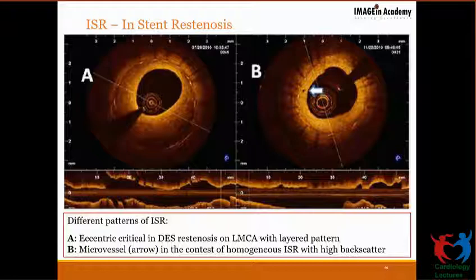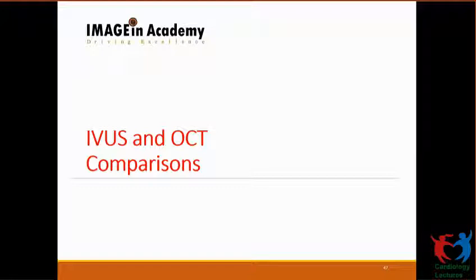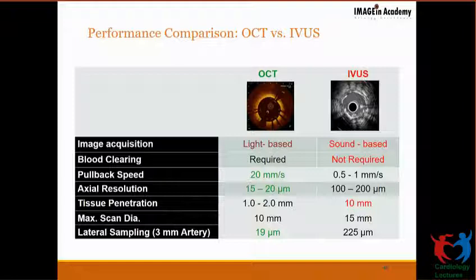Now, a very important question which comes up is, how do these two modalities compare? OCT has been riding on the back of IVUS. IVUS was the first modality which laid the foundation of imaging in coronary intervention, and it proved that if you image and implant a stent, you are assured of good end results. So how do these two modalities compare? We know that OCT, as I've been telling you, is light-based, whereas IVUS is sound-based. You need to clear the blood column with OCT, which is not required with IVUS because you're using the sound wave, so you are absolutely fine.